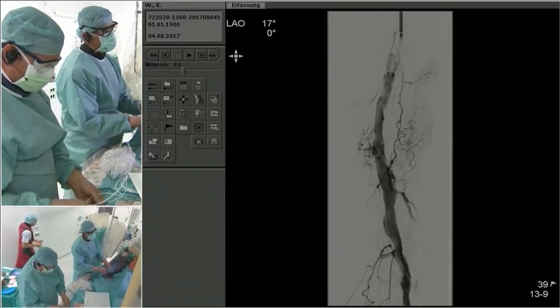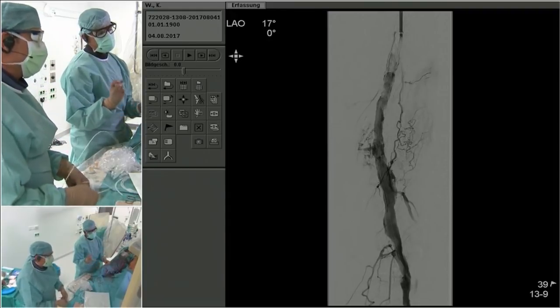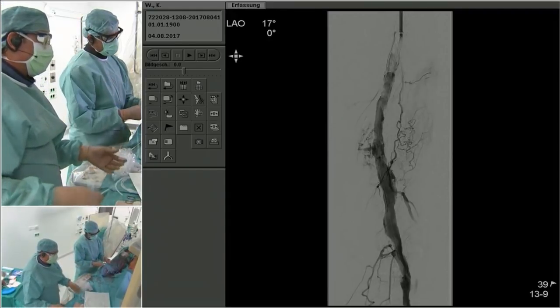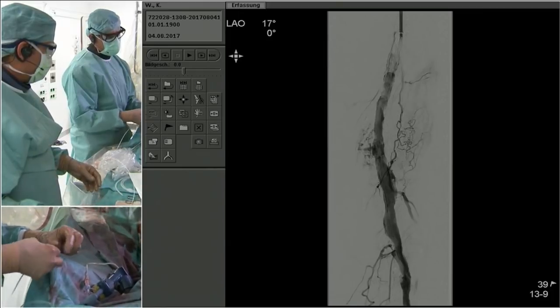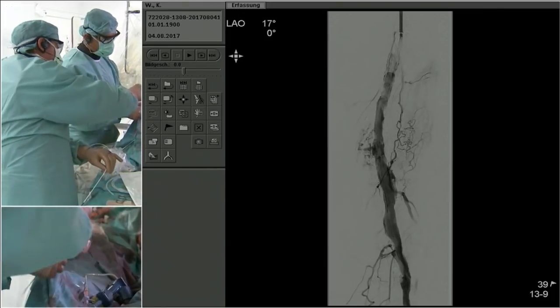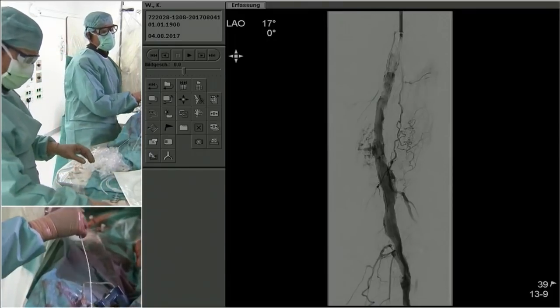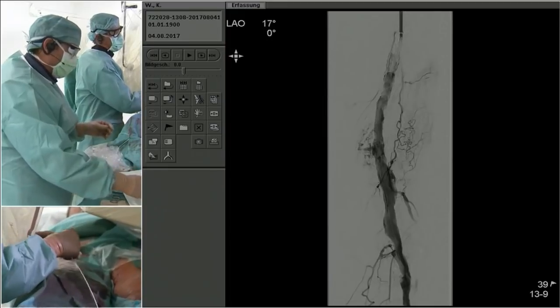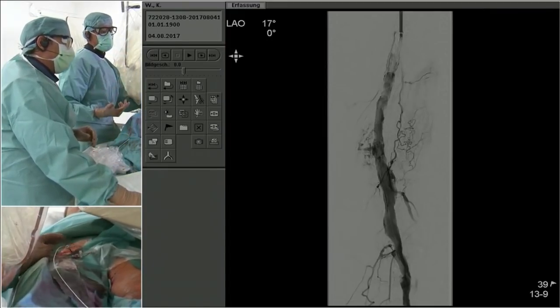This is not the reason really for me for a Viabahn. But distal to that, the artery is relatively dilated now. And we have seen cases where we really did all this preparation, which, as Mehdi said, is extremely important, to take your time here, to take the Supera in. When you have this kind of dilation of the artery, later on they come back and the Supera swims around a little bit.